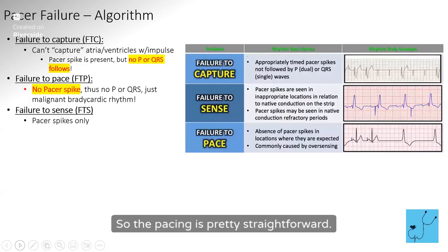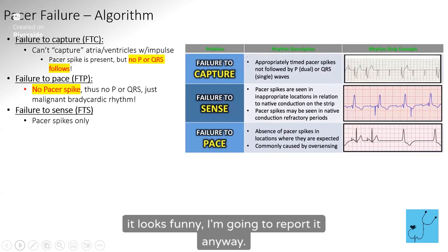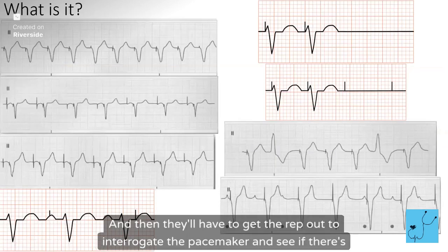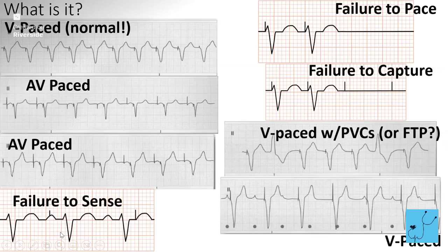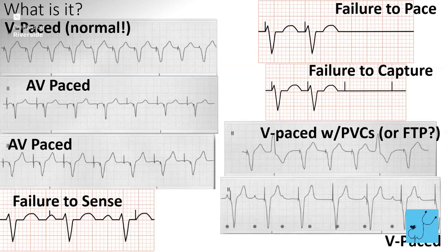So the pacing is pretty straightforward. You have a slide of the problems, but it's not important right now. Just know that if they were pacing 100% all the way along and now all of a sudden it looks funny, I'm going to report it anyway. They were pacing fine and now they're not. Then they'll have to get the rep out to interrogate the pacemaker and see if there's something wrong with it. Basically, if you have a spike and no beat, then obviously that spike did nothing. Or if you have a bunch of spikes and the patient still has a rhythm, that's not right either.